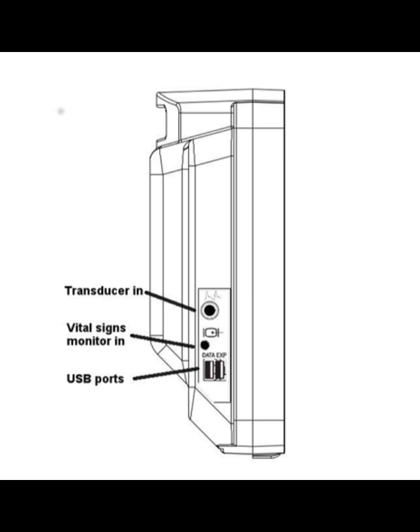When the Argos is powering on, on the left-hand side of the Argos, you will connect the cable from the Argos to your bedside monitor. This is the data acquisition cable that will collect the data to process through the multi-beat analysis algorithm and provide you your advanced hemodynamic parameters.